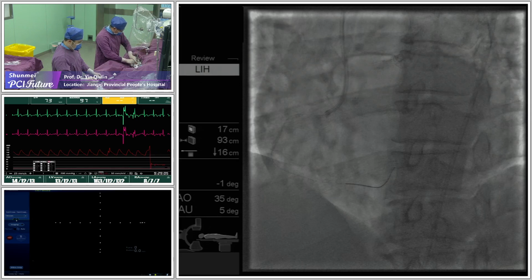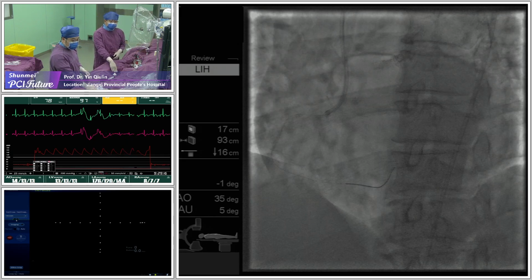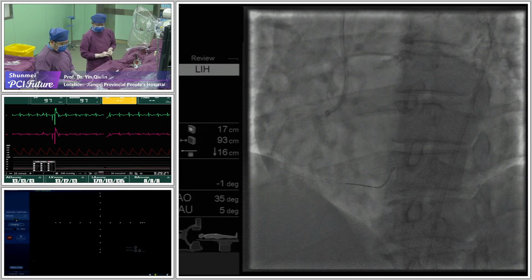Bias, and so I think GN4 must be one of the options, but how to shape the wire and how to control it is of most importance. Just a comment. Once, yeah. Oh, sorry. Go ahead, please.